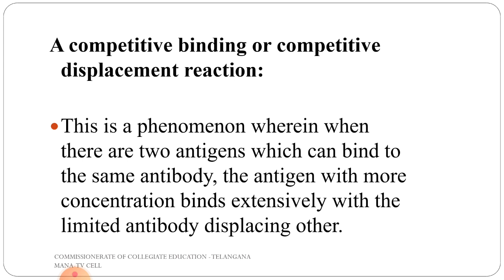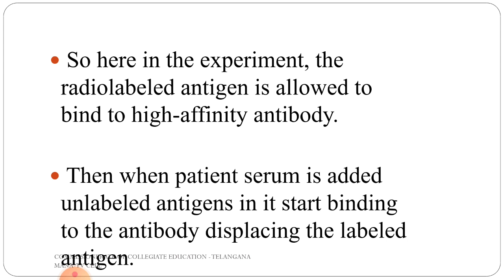The second principle is about competitive binding or competitive displacement reaction. This is a phenomenon wherein when there are two antigens which can bind to the same antibody, the antigen with more concentration binds extensively with the limited antibody, displacing the other. So here in the experiment, the radiolabeled antigen is allowed to bind to high affinity antibody. Then when patient serum is added, unlabeled antigens in it start binding to the antibody, displacing the labeled antigen.